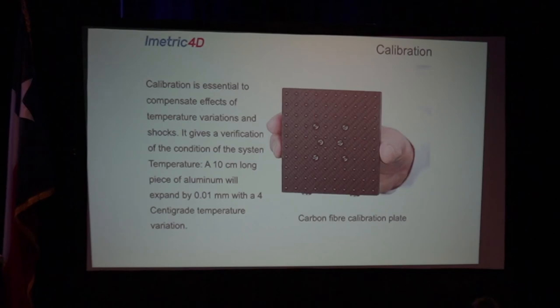So all these little things are thought of, whereas the Pic system, not even calibration, because that's my problem with iTero, right? iTero doesn't even show you how many images there are when you take the intraoral scan. So if you have so many images, it's going to be hard for that camera to stitch together, and you'll notice that it'll just start scanning slow because it's struggling, and then you're adding distortion in there. But their idea is like, oh, we don't want to show those numbers, dentists don't need to know that. Whereas with a Trios or a Medit scanner, it's showing you all the images it's taking because it knows the more images, the bigger the file, the more stitching, the more errors you can introduce.